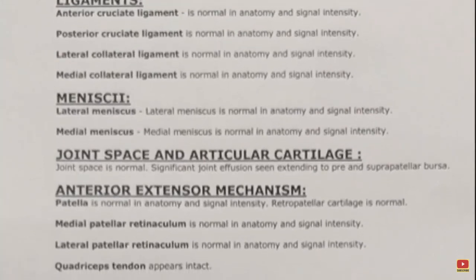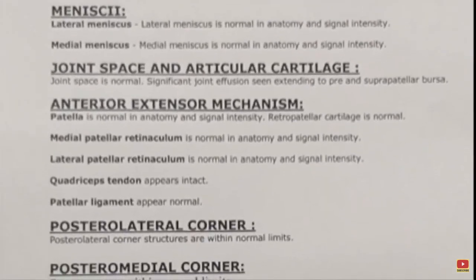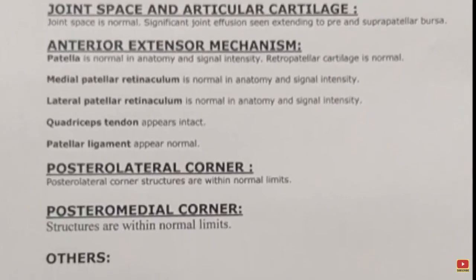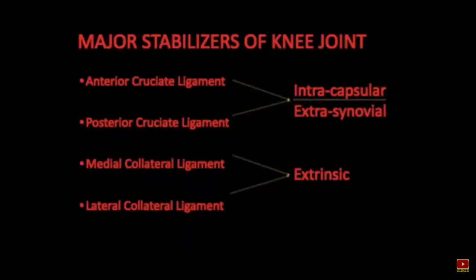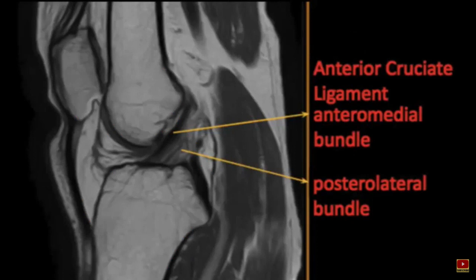This is the format I follow step by step while reporting an MRI knee. Number one, I see the ligaments. The four basic ligaments I assess are the anterior cruciate ligament, posterior cruciate ligament — which are the intracapsular extrasynovial ligaments — and then the collaterals. The ACL has two bundles: anteromedial and posterolateral. For any ligament pathology, we look for three things: ligament contour, disruption of fibers, and any abnormal signal.